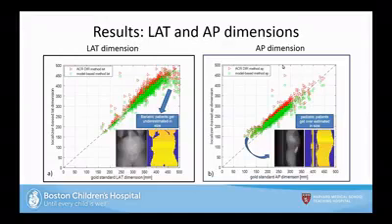As you can see here, some of these points were special cases where the patient had their arm up, so it was a garbage in, garbage out situation. And all these points here were due to bariatric patients. The problem with the ACR DIR method, that extraction method I described, is that if the patient takes up the entire CT scan, it will erode away a lot of that patient. Because it does that, it underestimates the patient size. That's why these points here fall below that line.